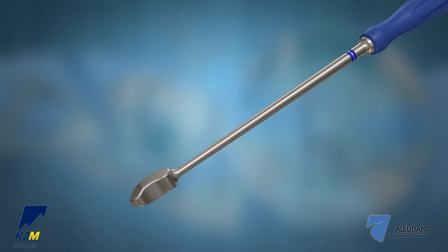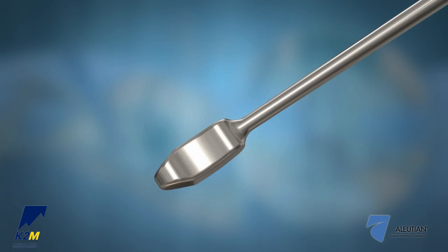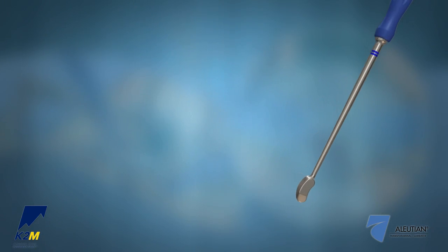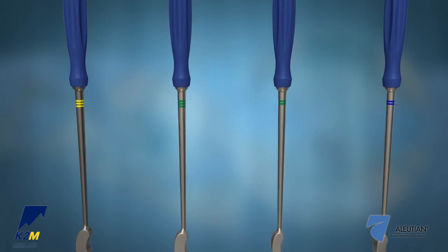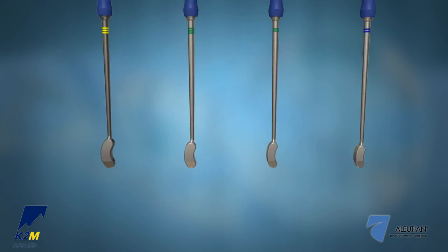Trials have 7 degrees of lordosis and are undersized in height by 0.5 millimeters to allow for a slight press fit of the respective implant. If the trial appears to be too small, gradually increase the size until a secure fit is achieved. There are color-coded bands on the shafts of the trials to indicate the footprint of the corresponding implant.